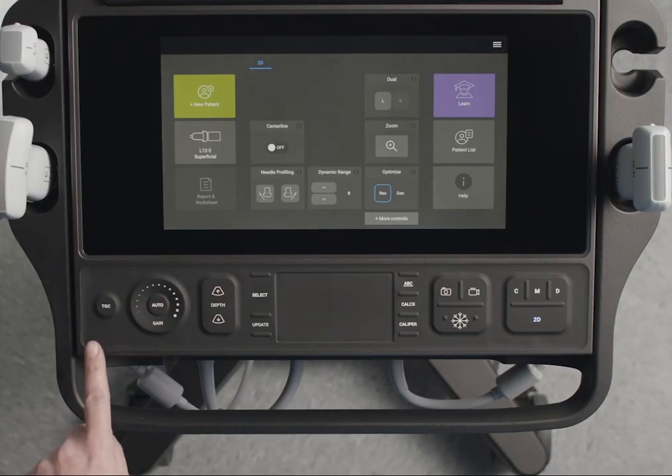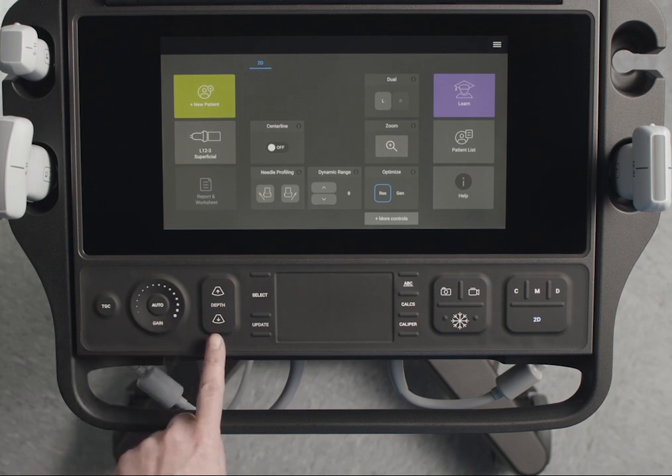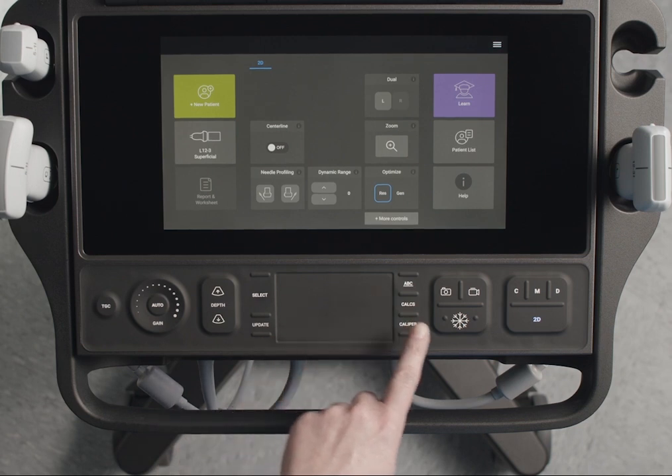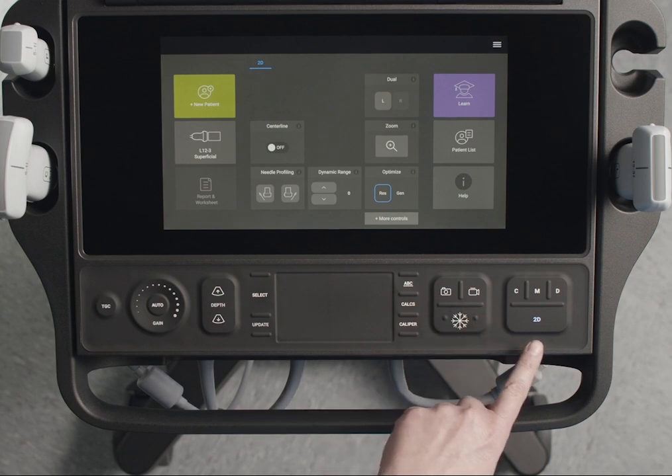The Sonosight PX has physical controls to adjust the image. These include gain and depth controls, a touchpad to control items on the monitor, the ability to freeze and save images and clips, and imaging mode controls.